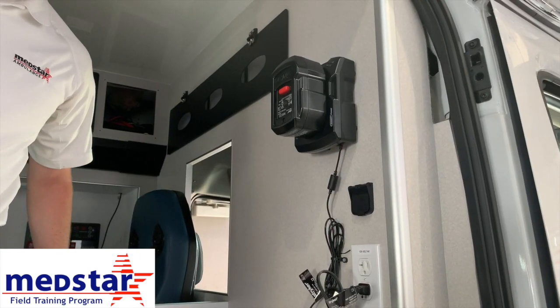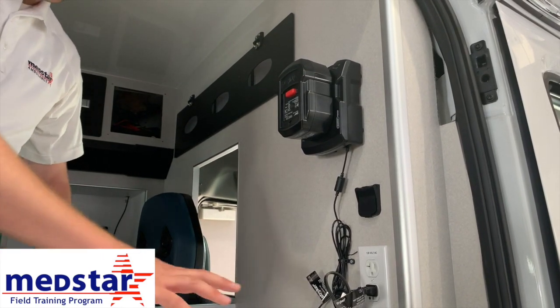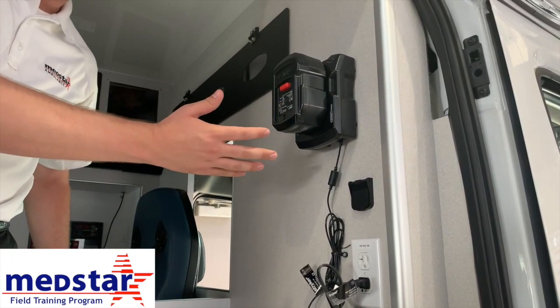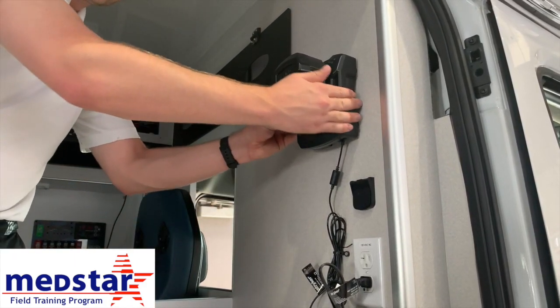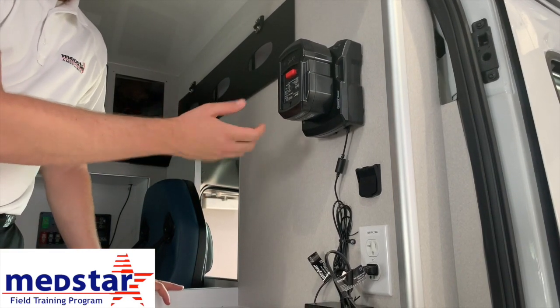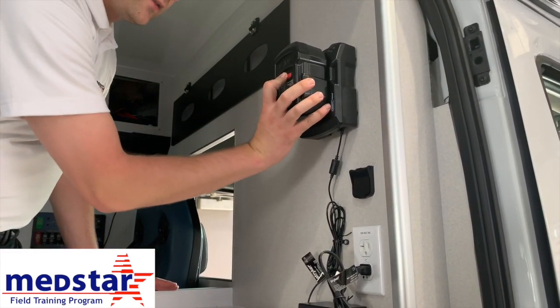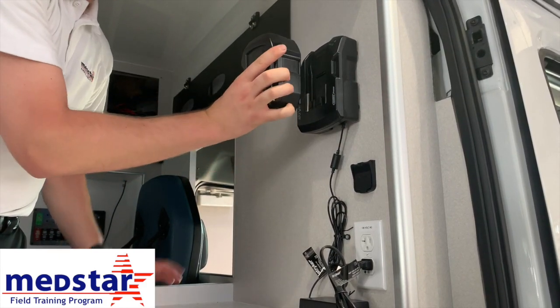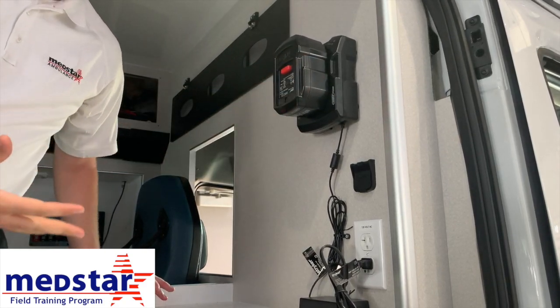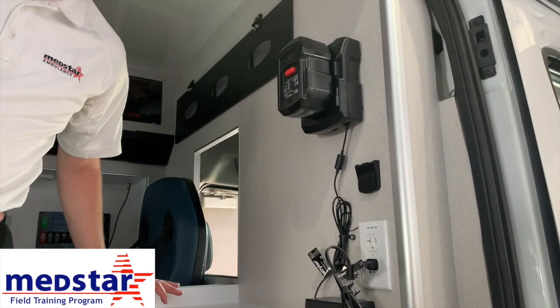In our transit-style vehicles, just inside the side sliding door above the counter is where the spare battery and the battery charger are mounted. It's mounted to the wall so it's not a free-floating object in the back of the truck. To take the battery off, push the red button to release, lift up, and pull straight out. To put a battery on the charger, line it up, slide it down, and you should hear it click into place. If it didn't click, it is not appropriately on the charger.